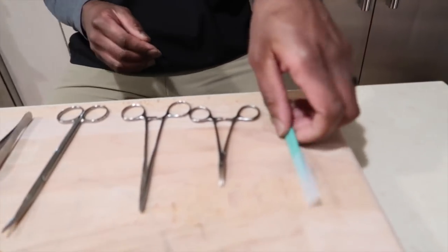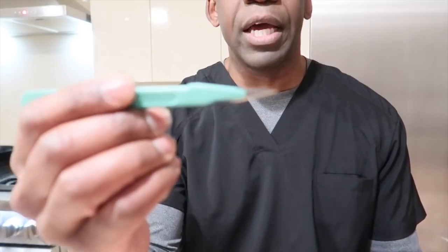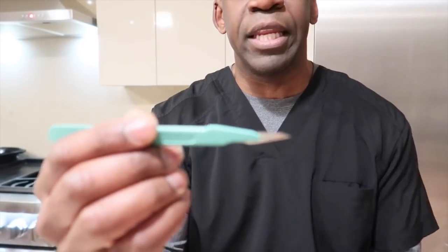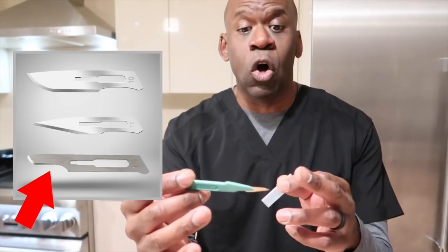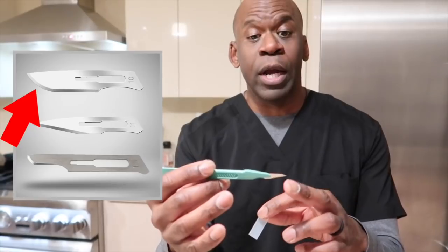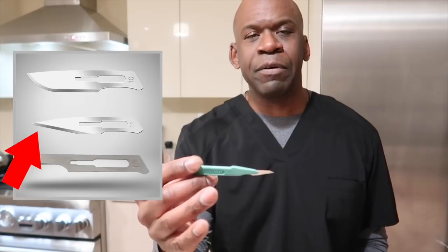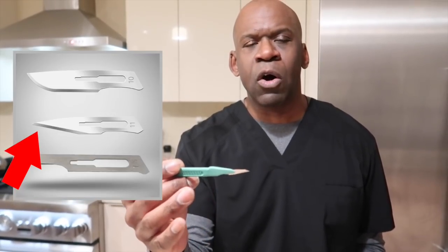I have here an assortment of instruments I might typically use if I were doing a small procedure. The first thing, if we're going to operate on something, we're going to have a knife or a scalpel. This is called an 11 blade — that refers to the shape of the blade. In orthopedics, we use 15 blades, which is a very small rounded tip blade, and number 10 blades, which are rounded but very large. Those are our primary skin scalpels. We use 11 blades when we want to make very small holes, such as for arthroscopy.